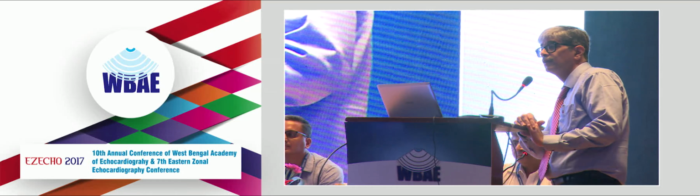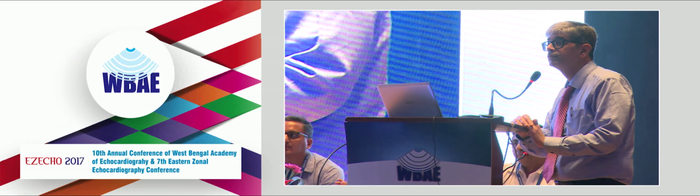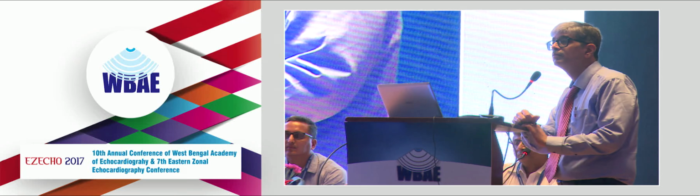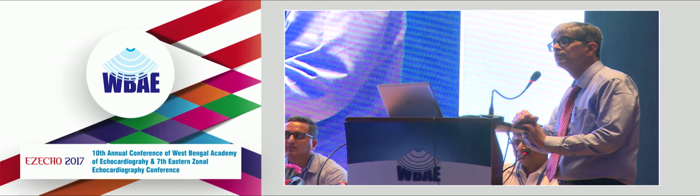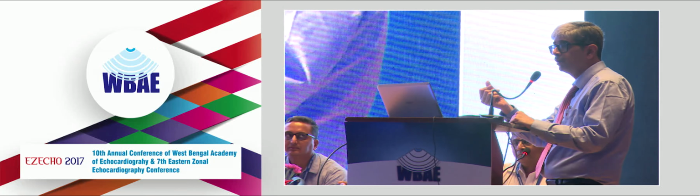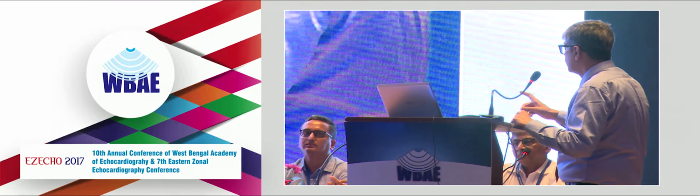Yes. The views which everybody must use to gather the maximum amount of MAPCAs that are there are very essential, because the MAPCAs have to be closed before surgery. Most of the echocardiographers see one MAPCA, two MAPCA, but they do not plot all the MAPCAs. So can you enumerate the views that you should take so that the common echocardiographer... I'll just make one point, we'll come to that. We were just on the MRI, but we'll subsequently come to that.